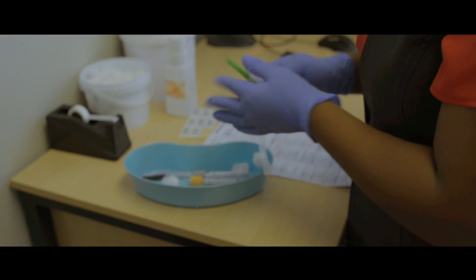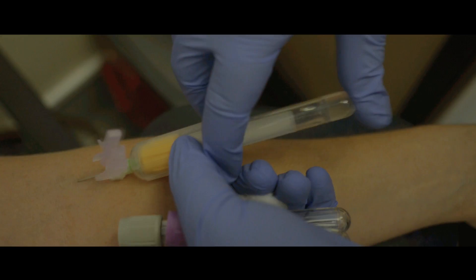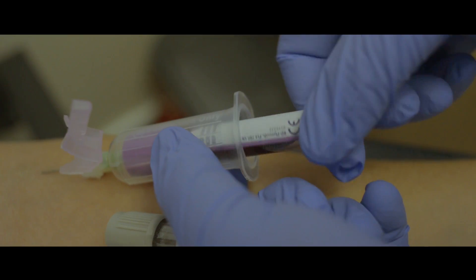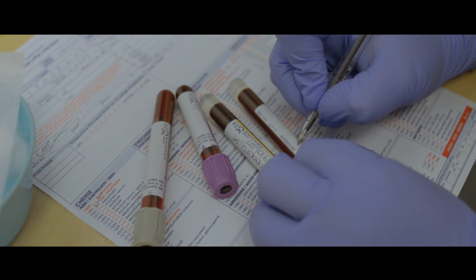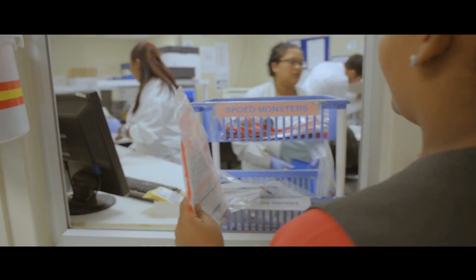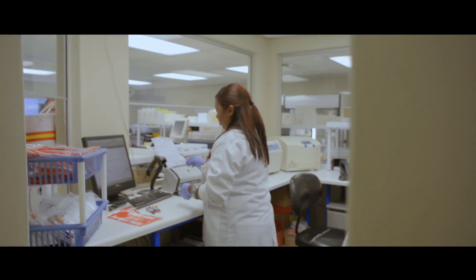We are what we call a STAT laboratory, so we try to process all the urgent samples here as quickly as possible. Some of the more routine blood tests which require urgent attention we do in a laboratory like this. What our girls at specimen reception do is establish whether the samples are being processed here or if they can send them off to our head office.